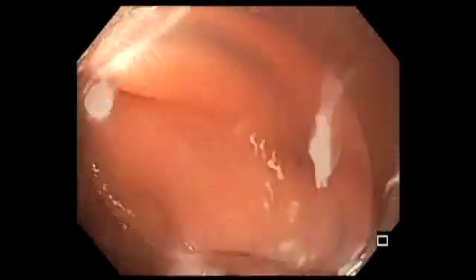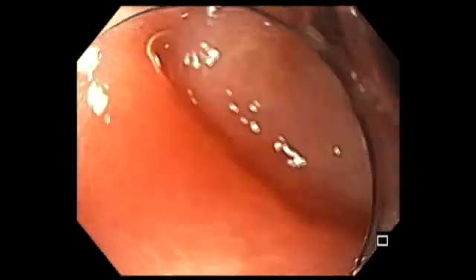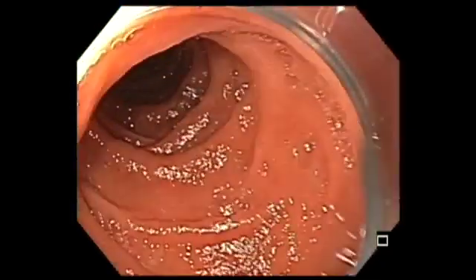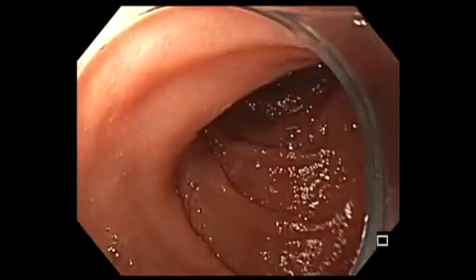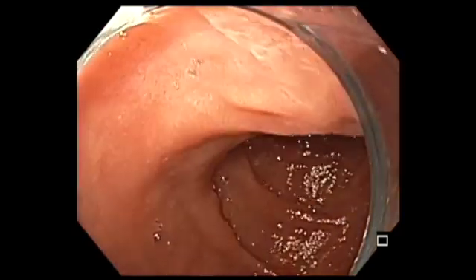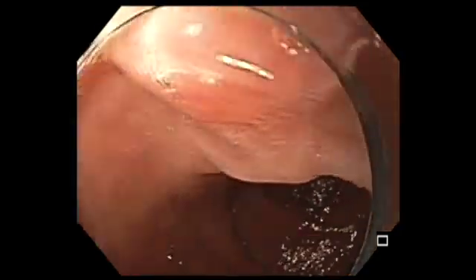I have had at least two patients so far where we picked up ampulla adenomas in the last one year, with the use of a cap and routinely looking for the ampulla as I am doing it now.